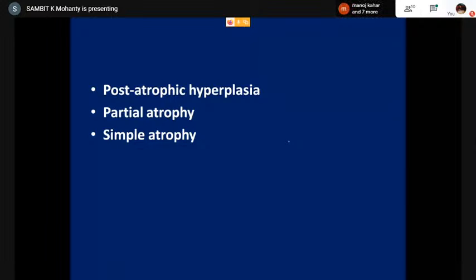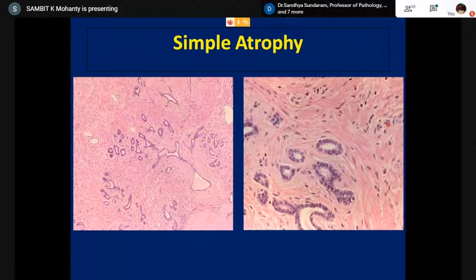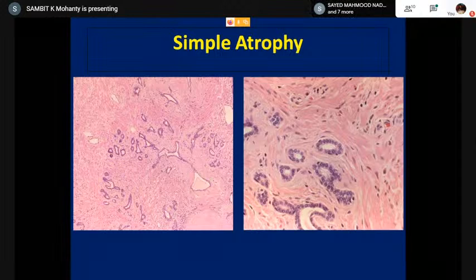You do see a lot of prostatic atrophy. It's like senile atrophy, like in any old person, like in breast in women, and prostate in men, they undergo atrophy. So in atrophy, the first thing you see is that the nucleus looks a little big. Why? Because there's loss of basal, lateral, and apical cytoplasm. The first thing to go is the apical cytoplasm, then the basolateral cytoplasm. So they kind of compress and hit on the basal cells. The basal cell layer is usually not visible, and the stroma looks more fibrotic, a little slate gray and fibrotic.